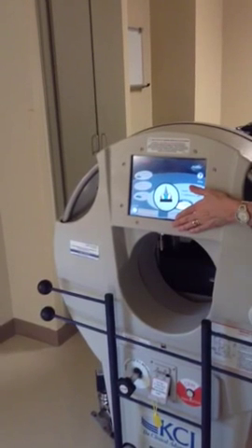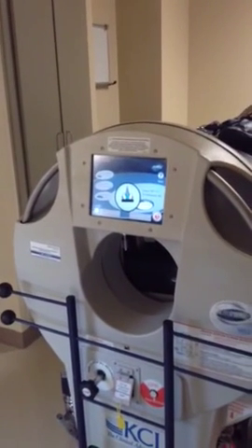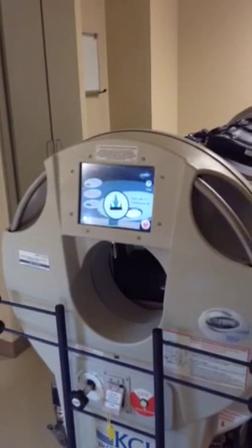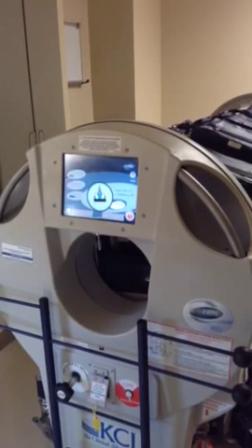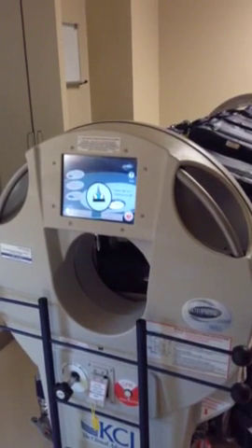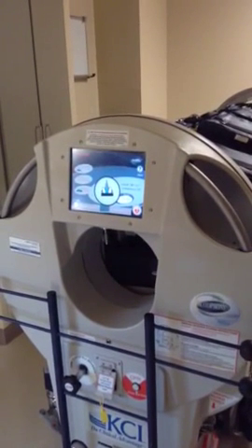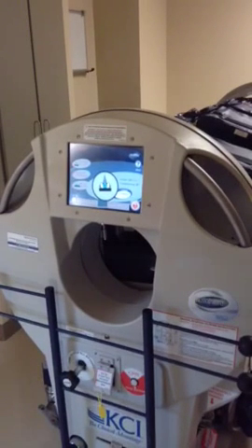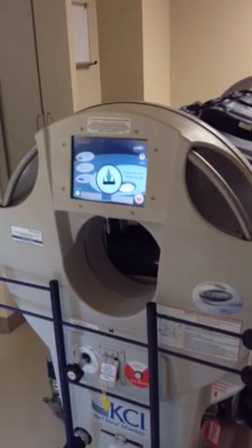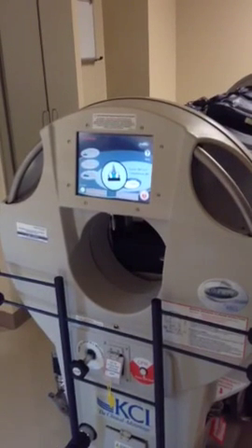Even if you have to close the doors, if you close them really quickly, but even if it takes a minute, the risk you run with pulling that if you don't have to is if you've gone down clockwise and you're in the middle of a code situation, you just continue all the way in your turn clockwise and you've turned the patient 360 degrees. You can extubate the patient, you can pull the lines out, you can snap the belt inside of this unit. If it goes 361 degrees, there's a ribbon cable inside of there that snaps, and then you're done. Plus, you might extubate the patient.